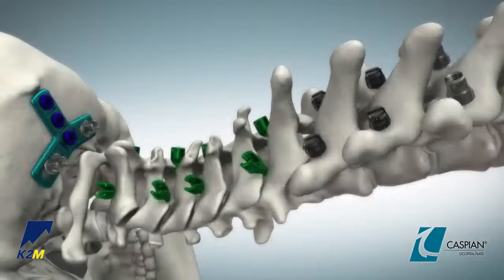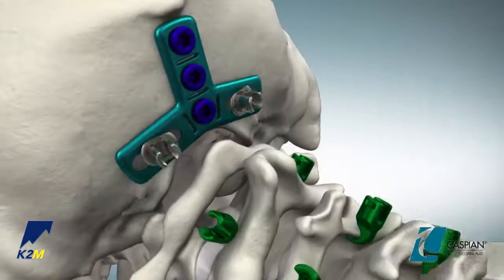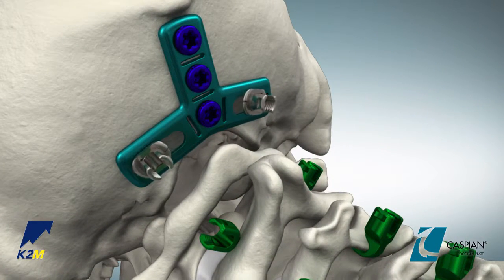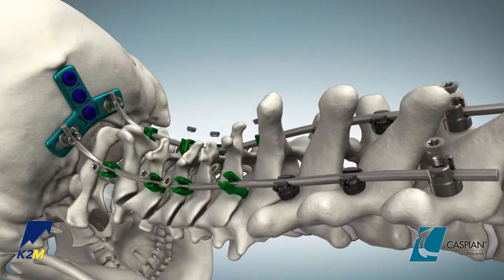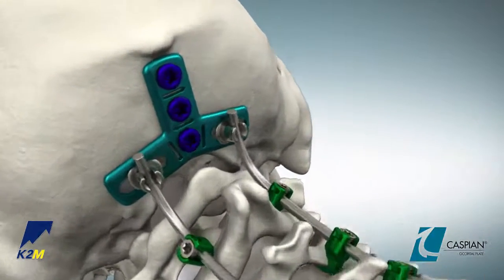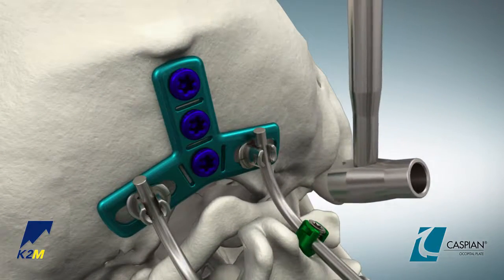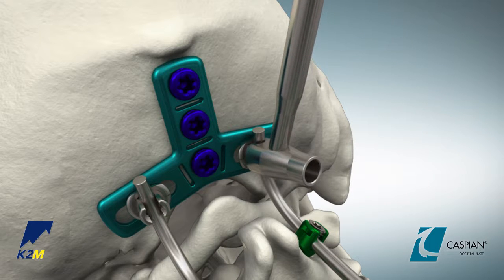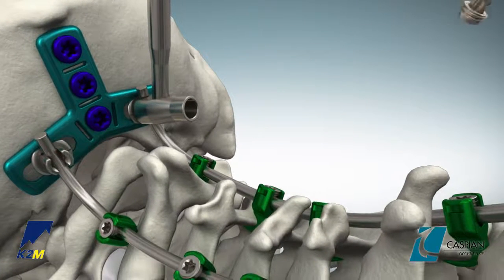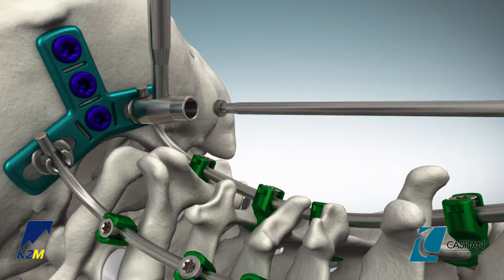Introduce the prepared rod into the hooks and screw construct and align the lateral adjustment screw heads to accommodate the rod. Then lock the rod to the hook and screw construct. If slight reduction of the rod is necessary, place the anti-torque guide over the rod and gently push down over the screw head. Then use the size 15 tapered screwdriver to pass a mini set screw through the guide and provisionally tighten in the screw head.